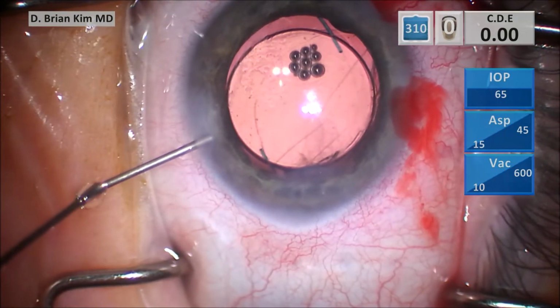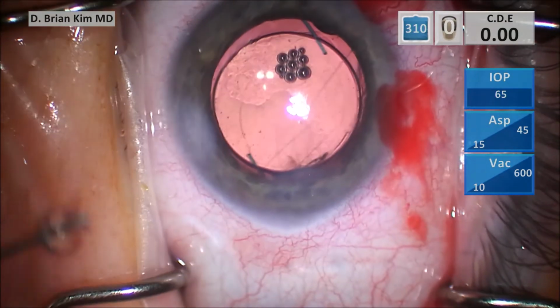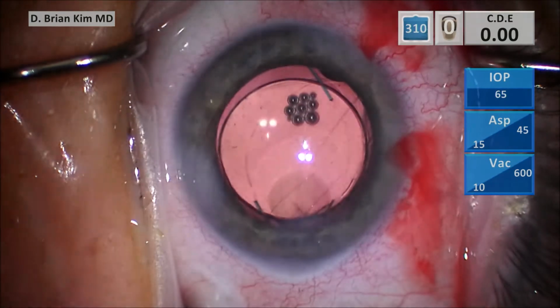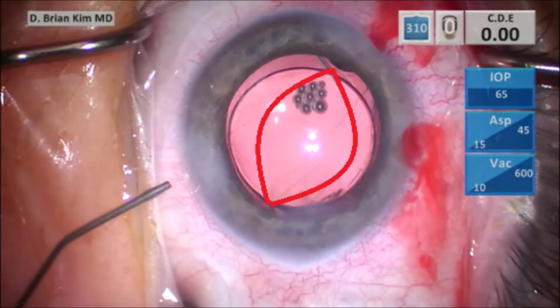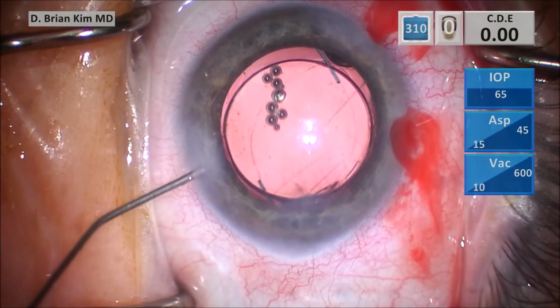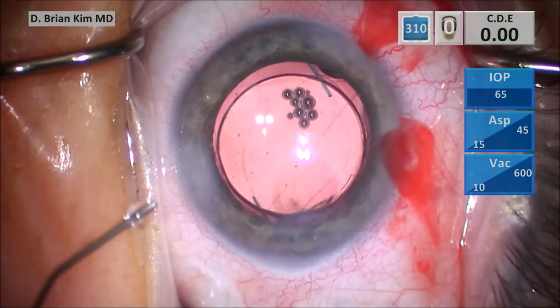So I go ahead and hydrate my incisions. You can see that the lens is well centered now. I have good optic capture configuration, despite having a little bit of an asymmetric optic capture there. There's more overlap on the left side here than the right side, but I felt pretty confident that I got pretty good overlap on each side. Even though it's slightly asymmetric, I have pretty good overlap, and I do feel this is a pretty stable situation for this lens.